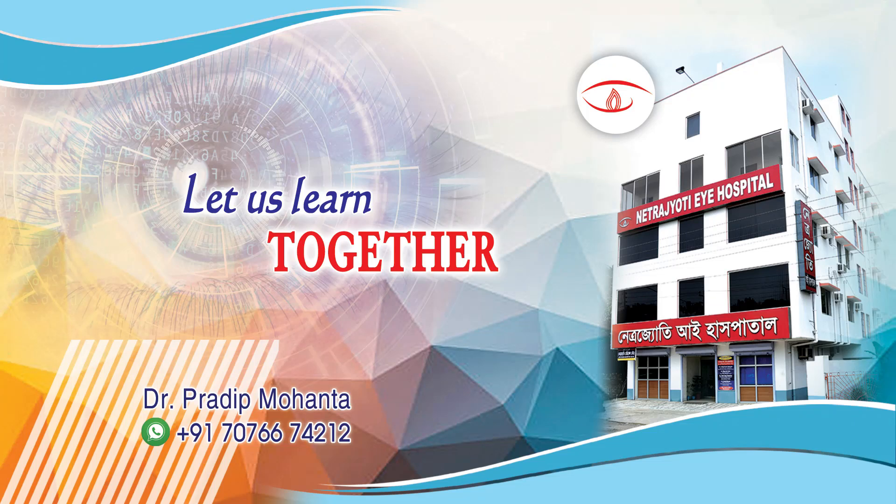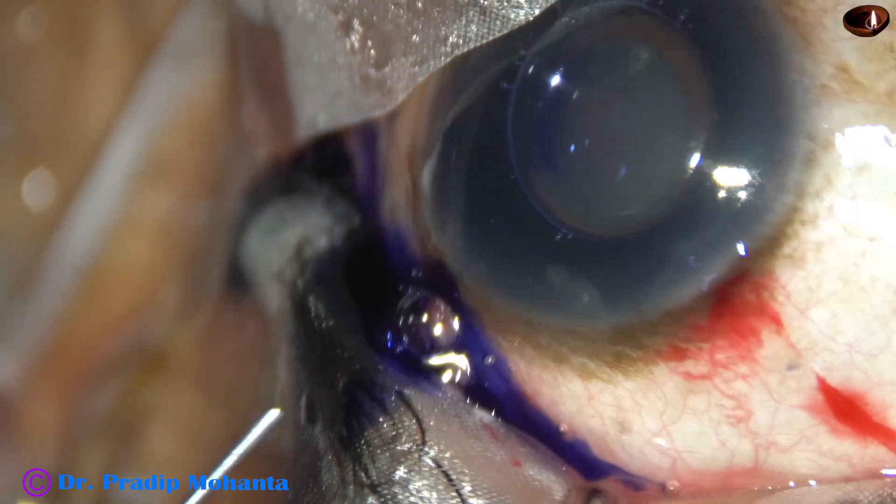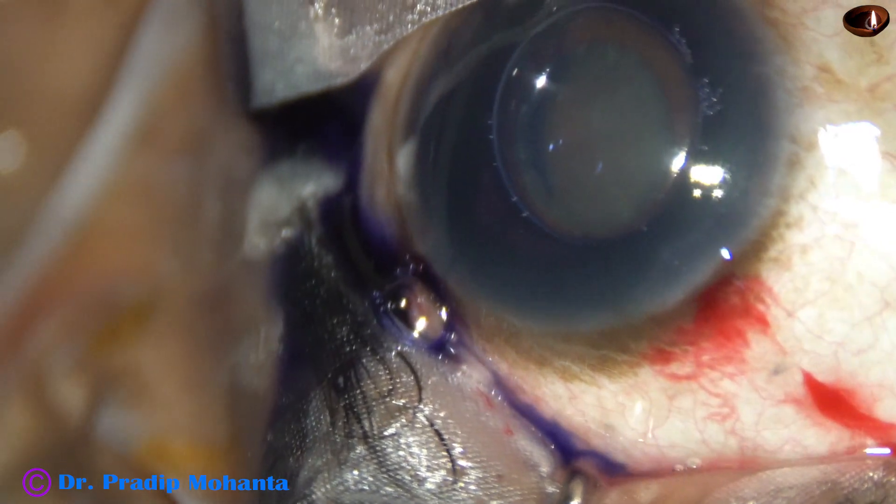Friends, welcome to my workplace at Ranakh Heart, West Bengal, India. This is a cataract case with a small pupil. Let us observe the management of this case.